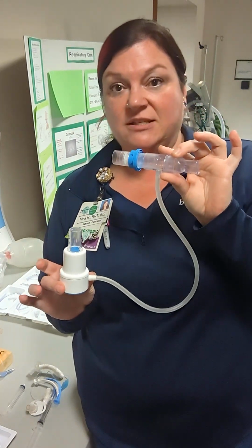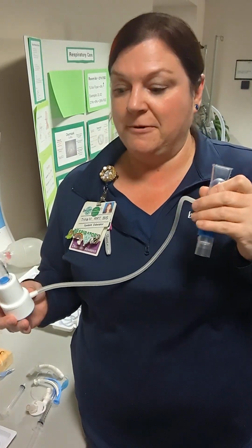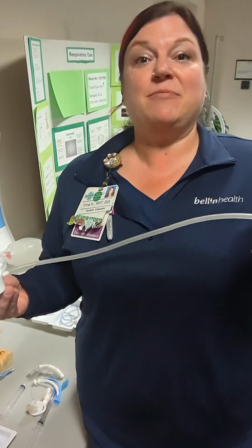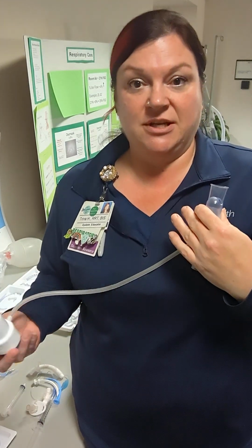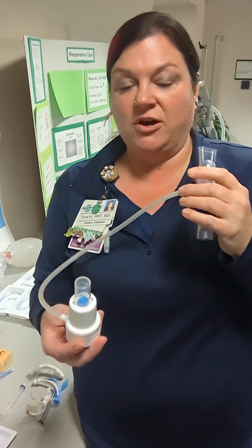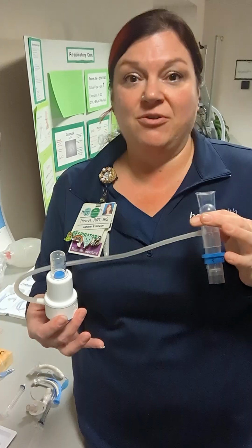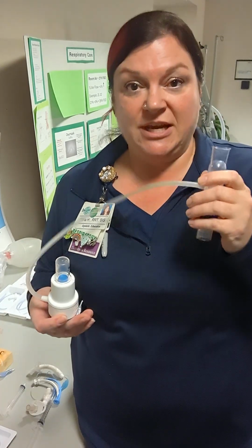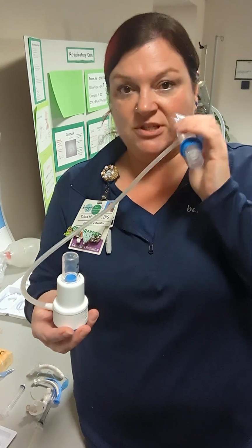And so this does the same thing as IS for expansion therapy, except they get to exhale. They don't have to take a deep breath in. They can do a prolonged exhalation, and that pressure is going to go back to their lungs. Promote expansion, recruit alveoli. Now the alveoli are plump and able to exchange gas. O2 saturations will go up because the alveoli can do their job. So this is what it looks like.